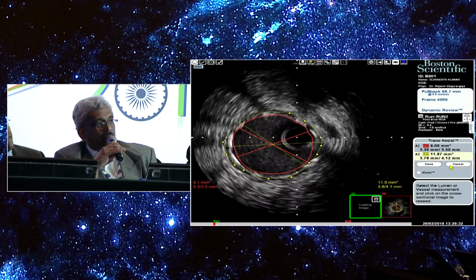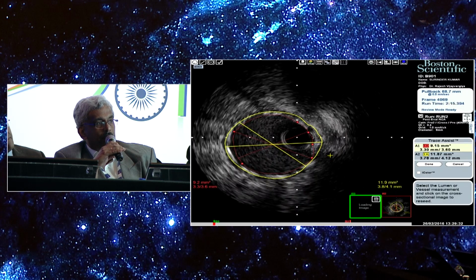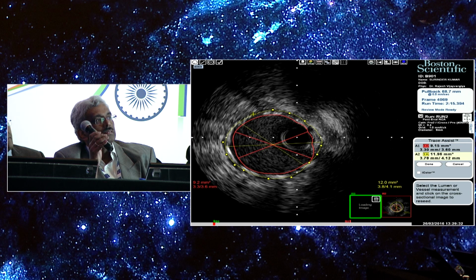I think right now there's no IVUS guidance needed to upgrade your balloon or your pressure. So on the basis of the IVUS, you're comfortable to leave this alone. Angiographically agreed, it looks okay. A little more, fine. Possibly the angiogram could look at it, but IVUS is better for this decision. I think it's a satisfactory result.